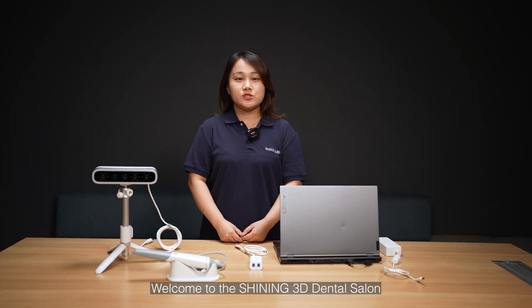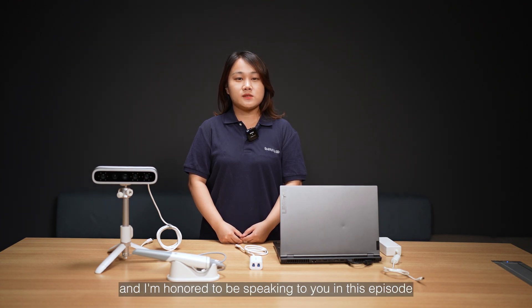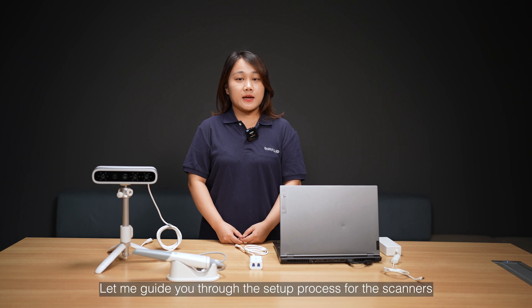Hello everyone. Welcome to the SHINING 3D Dental Salon. I'm Winnie, the Account Manager of the Dental Team, and I'm honored to be speaking to you in this episode. Today, I will demonstrate how we can seamlessly integrate the MetiSmile face scanner with our SHINING Aoralscan 3 intraoral scanner, making your workflow smoother and eliminating tangled cables. Let me guide you through the setup process for the scanners.